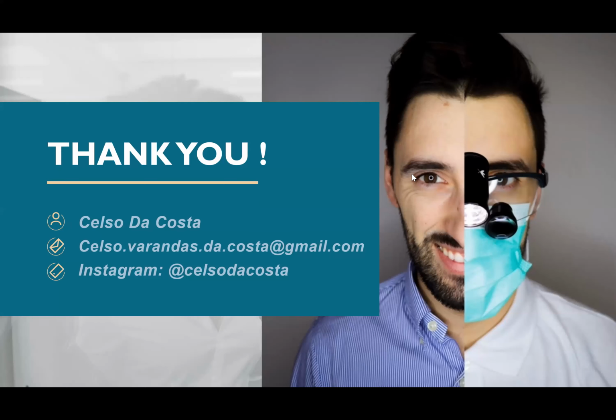The system really needs energy from the photons to activate and to break down the peroxide in such an efficient and fast way. So yes, you can use other lamps. Most lamps will work. Probably you will need to increase the time, and probably you will not get the same result. A curing lamp can be an option, but not a very good one. You will not get what you should expect from the treatments with this type of lamp.